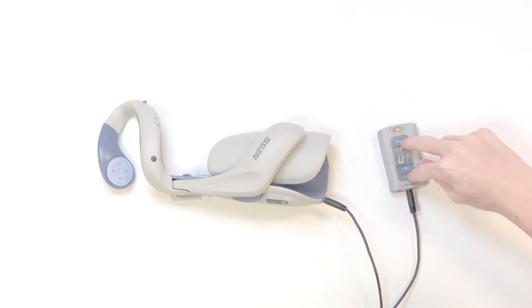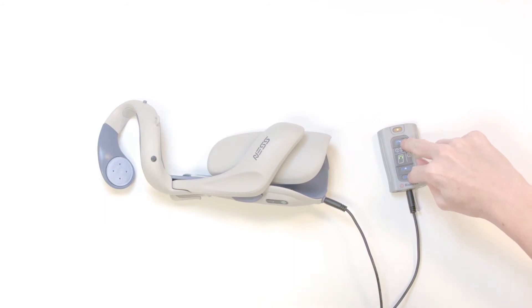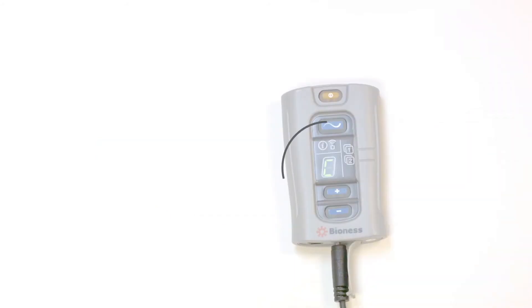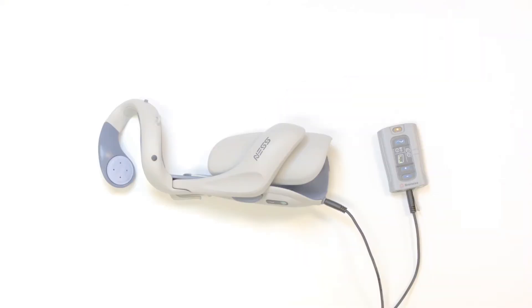Press and hold the minus and mode button at the same time for about 3 seconds. After a moment, the letter C will appear on the control unit. This means the orthosis has successfully paired.